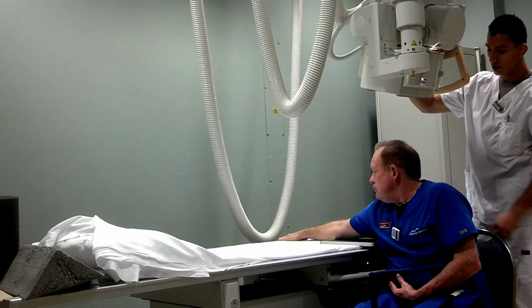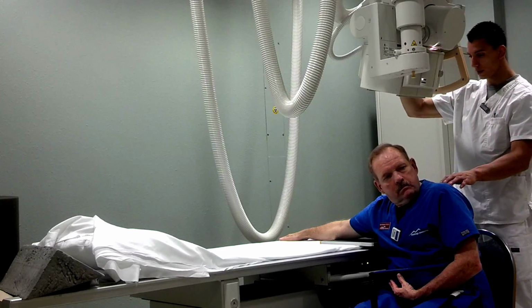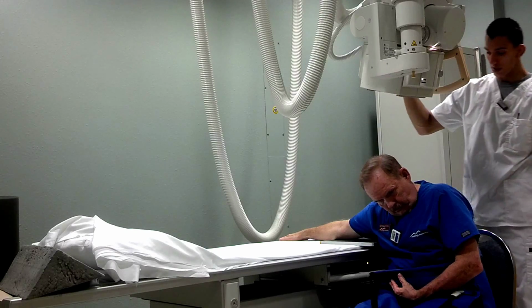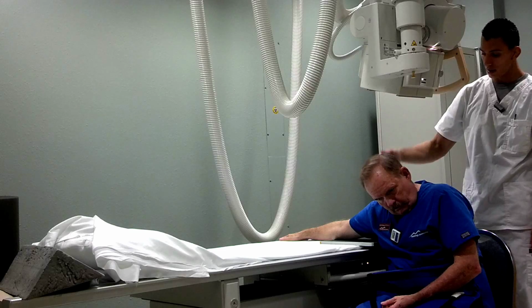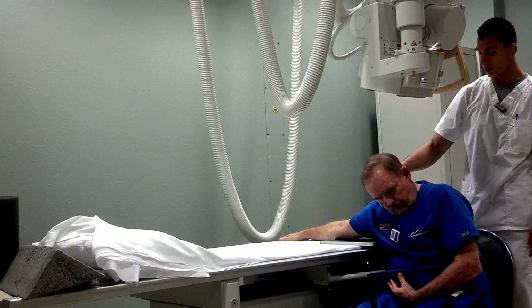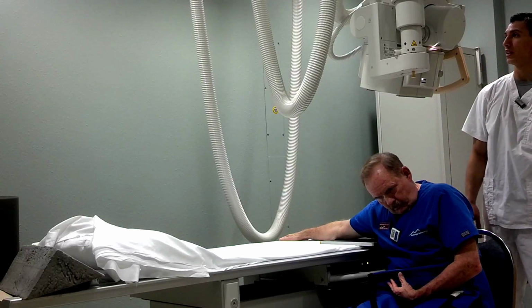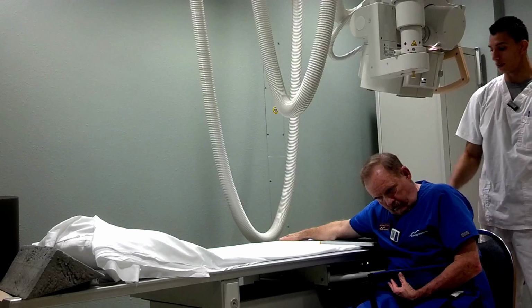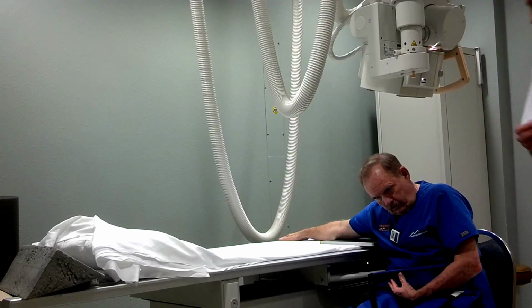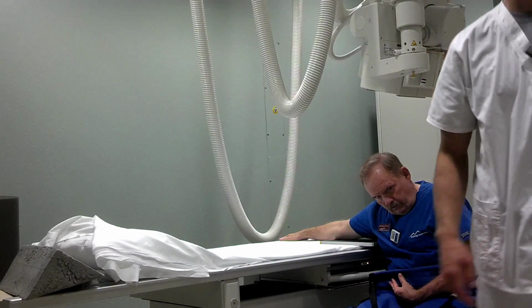And you're going to ask the patient, sir, can you look away from your right side, just look towards your left, please, and duck your head a little bit. There we go. The central ray is going to be perpendicular to his shoulder joint, which is right around the dimple on his shoulder, there. And again, angled distally towards the elbow, about 15 degrees. All right. And make sure that we put our marker on there as well for the right shoulder. There we go.